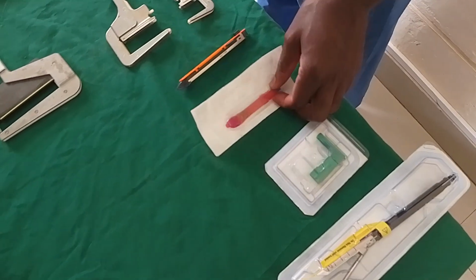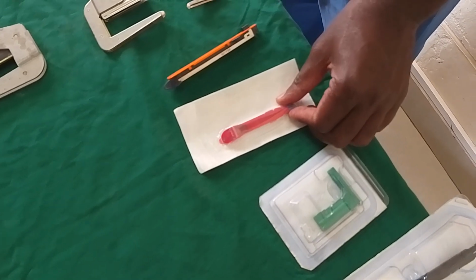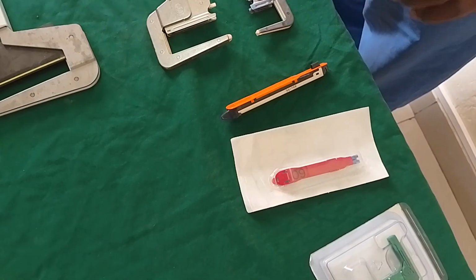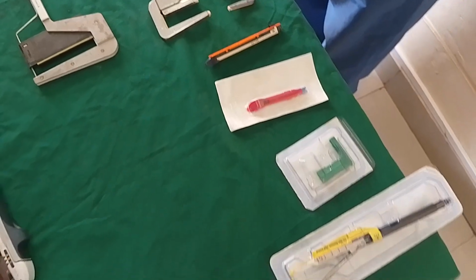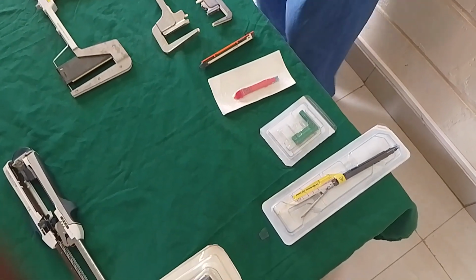If you find a blue reload, the blue reloads are used in bowel surgeries. And then gray reloads. Gray reloads are also used in vascular surgeries, and that's how we select our reloads to use with the surgical staples.